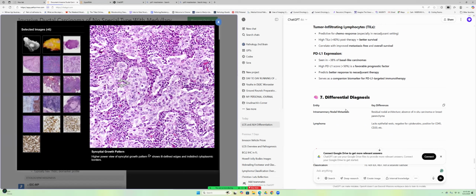The first is epithelial markers. Remember, you are comparing lymphoma to an epithelial carcinoma. If it's positive, then this is not a lymphoma. If it's negative, then you can start doing CD45, CD20. You don't want to start with the lymphoma workup. So start with CK5, CK6, or the most popular, AE1/AE3 or CAM 5.2, the pan-cytokeratin.